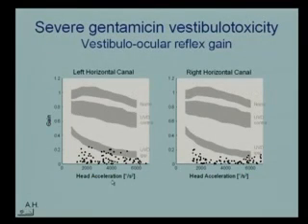This is a patient with severe vestibulotoxicity. Here's the gain in a normal. Here's the on-direction gain in a unilateral patient, the off-direction gain, and the gain in a bilateral patient severely affected is below that.